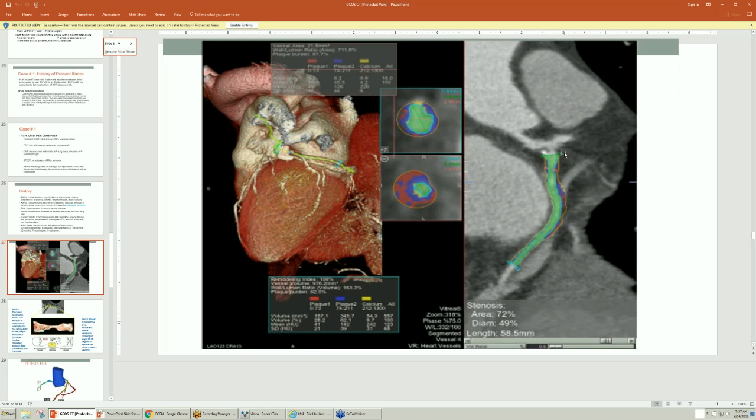The why is not the diameter. It's the relationship of this diameter to the amount of muscle that's being perfused. And so the fraction of myocardial muscle subtended by this artery is huge, because this artery is supplying not only the right coronary distribution, but the circumflex as well. And it's a hypoplastic right coronary artery on this patient. And so this is a dominant circumflex circulation that's supplying at least 40% of the myocardium, the LAD making up for the difference. And so that's why when this occluded, the gentleman went into shock because of the significance of the amount of myocardium subtended.